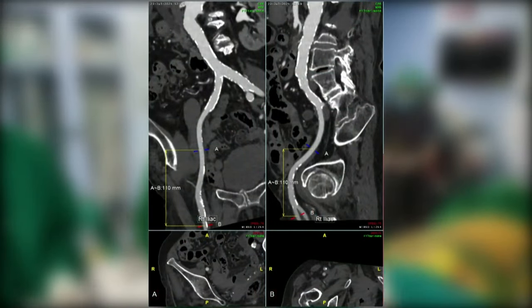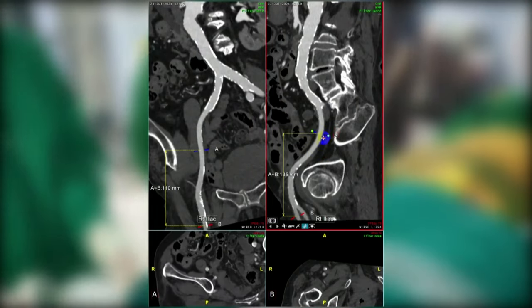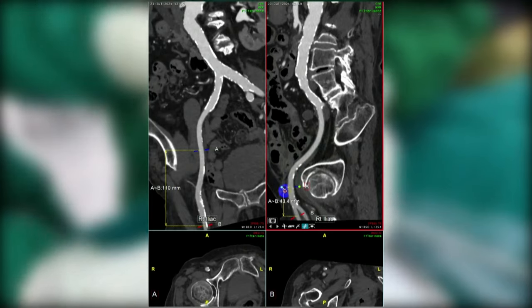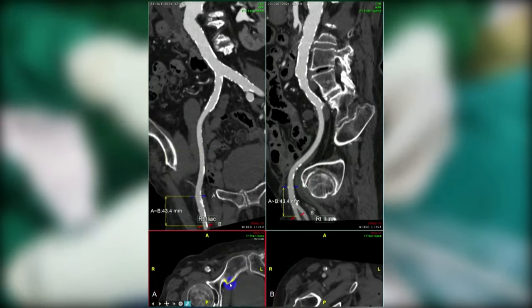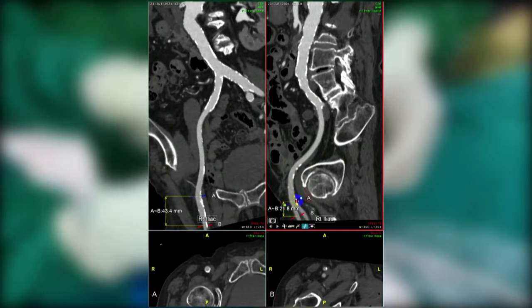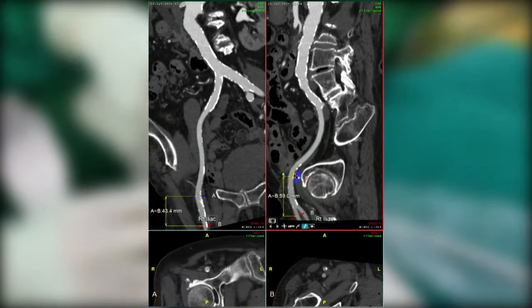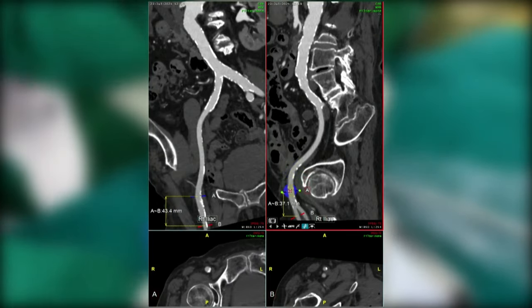In a patient, especially with structural heart disease, when they have had a CT done before, it would be nice to review the CT to assess the femoral artery on both sides. And you can appreciate from the CT which side is better for the puncture, where the calcium is located, whether it is anterior wall or posterior wall, and how it relates to the femoral head.